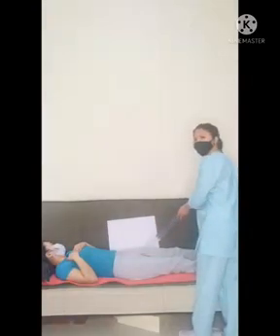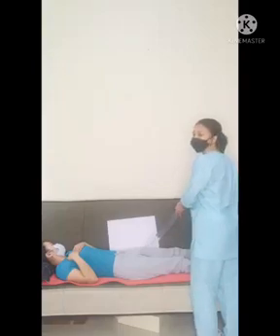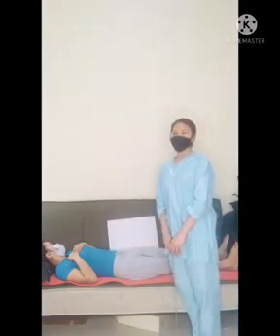So, our central ray in this projection is 25 to 40 degrees caudal, entering at the mid-sagittal plane at the level of the iliac crest, perpendicular to the plane of the pelvic inlet. So, the structure shown in this projection is the entire bony pelvic ring without superimposition.